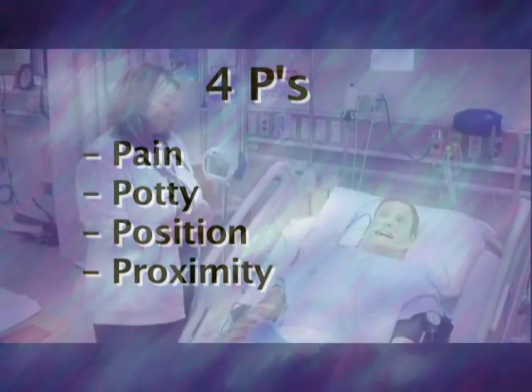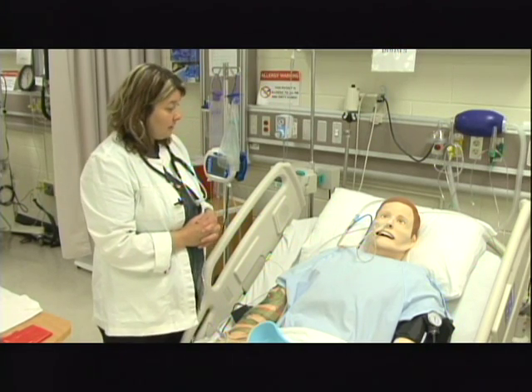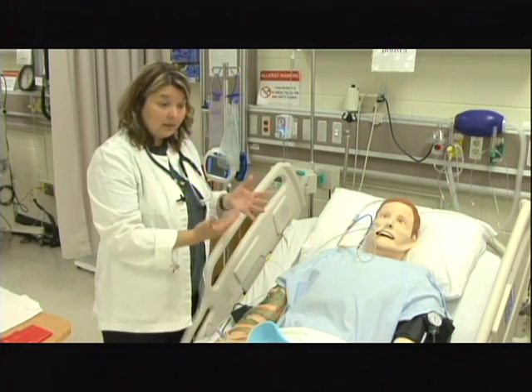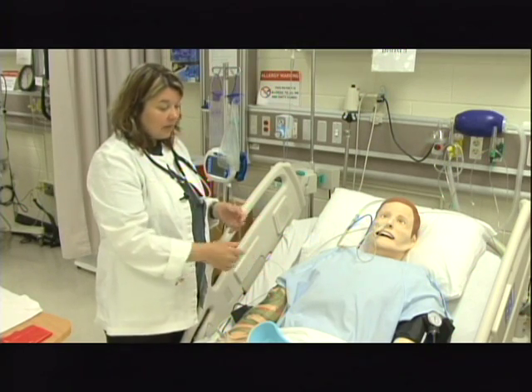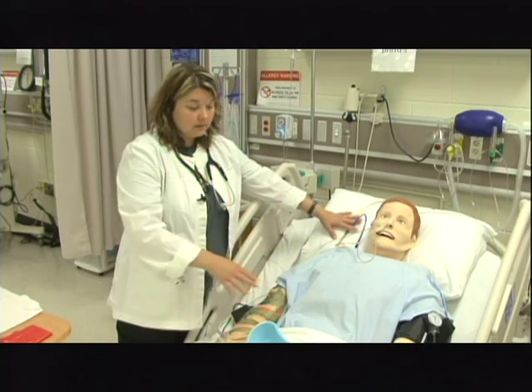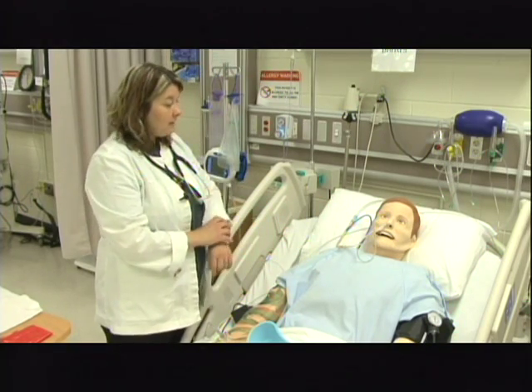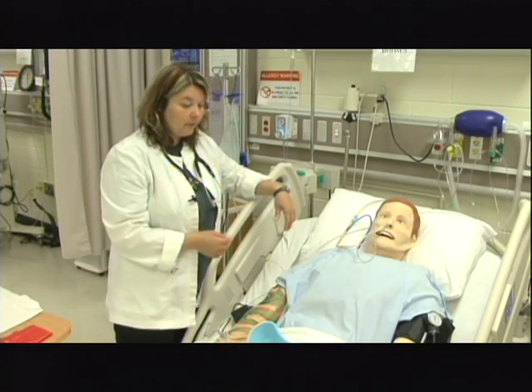The doctor has ordered that your NG tube can come out today, and it sounds like that you've been feeling better. And I'm going to make sure that, again, his picture is correlating with the assessments and things. I've listened to his bowel sounds with the suction turned off because, again, if the suction is on, all you'll hear is the suction. He has active bowel sounds. He's not complaining of any nausea. He has not been vomiting. He says he's feeling better.